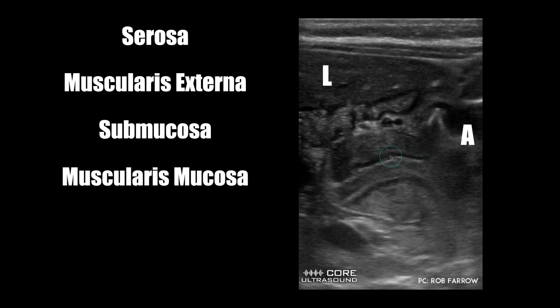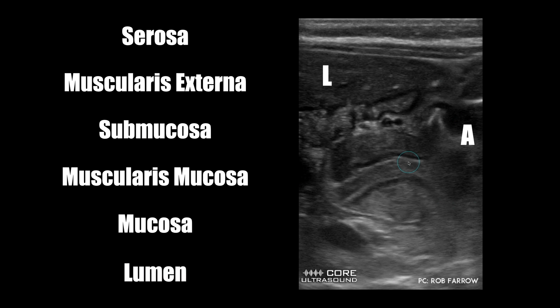Below the submucosa, you have the muscularis mucosa, which is typically hypoechoic, followed by a more hyperechoic mucosal layer. The final structure is the lumen of the pylorus, or the canal. Typically it's an open patent structure that has peristalsis going through. However, in a patient that has pyloric stenosis, the canal is obliterated, but this is the position of the canal to make the measurement.